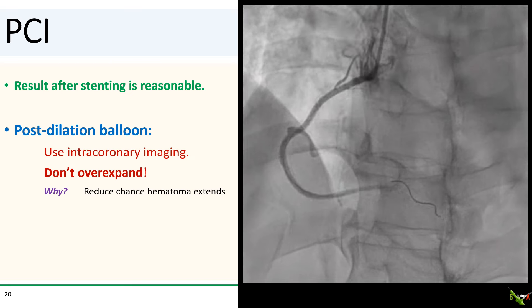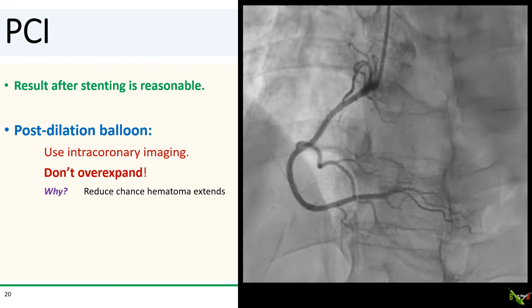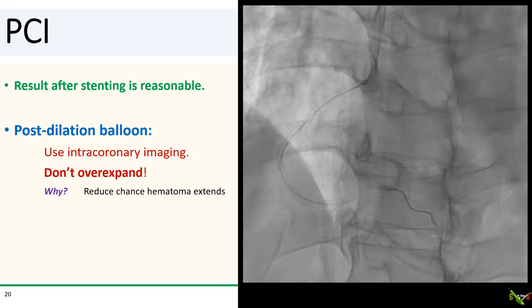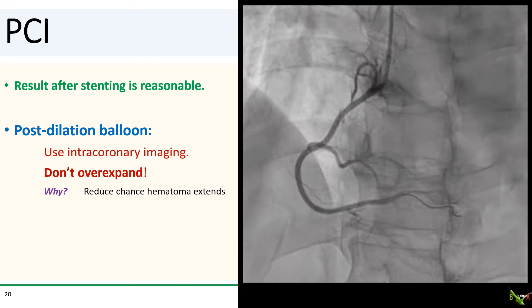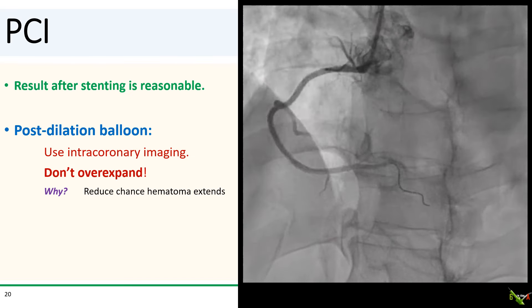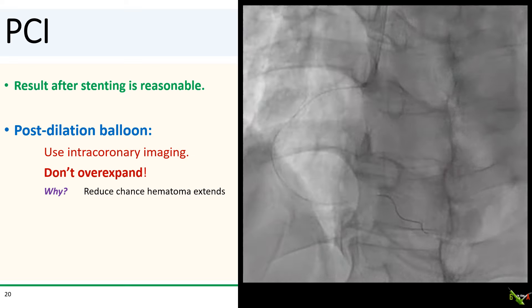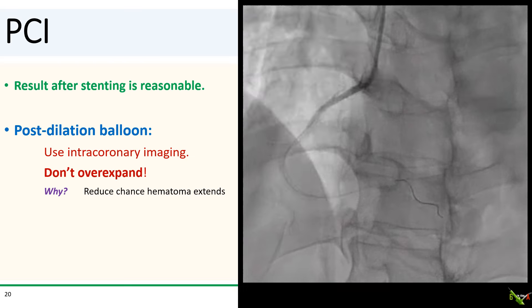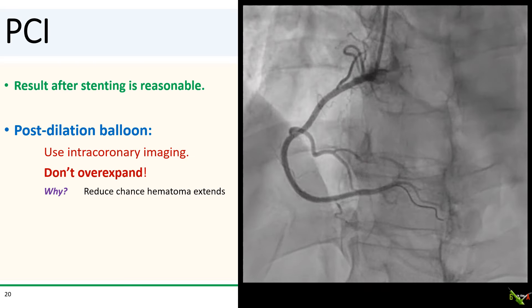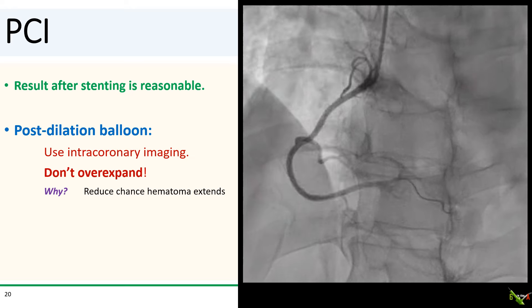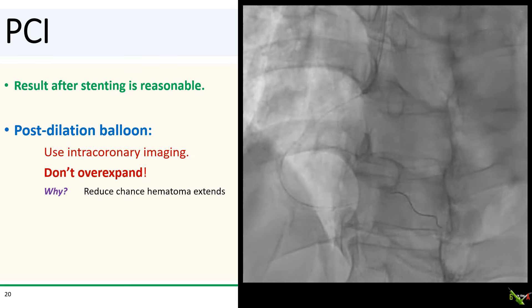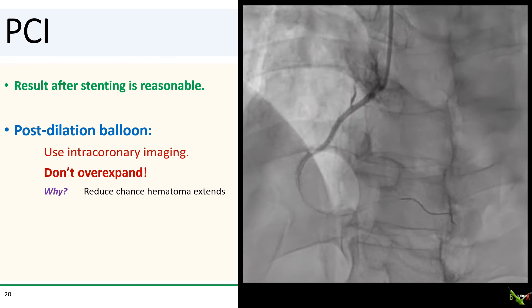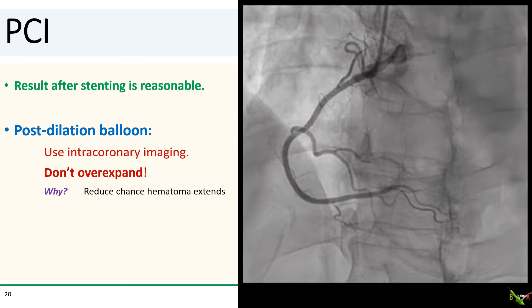Here we are after placing three long stents. We seem to be in good shape — the RCA looks quite good. Should we post-dilate? Post-dilating is something I'd nearly always recommend, but SCAD is again an exception. Overly aggressive post-dilation can also extend the intramural hematoma, and I've seen it propagate the dissection beyond the stented segment. SCAD is the one situation where I will tend to err on the side of a stent under-expanding rather than over-expanding. Appropriately sizing the stent is quite hard in SCAD because you can't always tell what the healthy tissue diameter is angiographically.